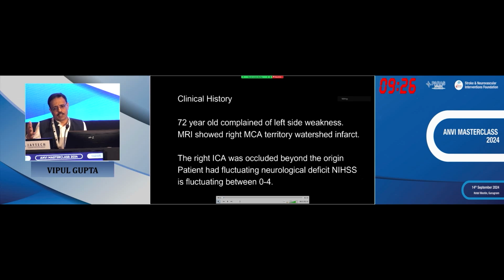Once you place stents, you don't know what you are entering into. For me, there are the bleeds post-stenting, and some of them are terrible ones. So the choice is, will he reinfarct versus a bleed? The chances of him reinfarcting are very low, very good ACOM. I could see that the vessels are filling. I think your venous phase would have been almost instantaneous.